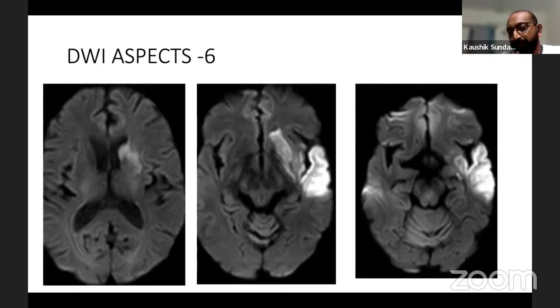How do you differentiate the two? No, I'm talking about if you have a carotid lesion. Now you have established it is chronic. Your collaterals are good. Your MRI is showing good evidence of mismatch, and you know that there is some amount of leptomeningeal collaterals that are working very fine for this patient. Correct? Now you know it is chronic. My only question to you is, is this a chronic stenotic segment that got occluded now, or is it a chronic total occlusion?